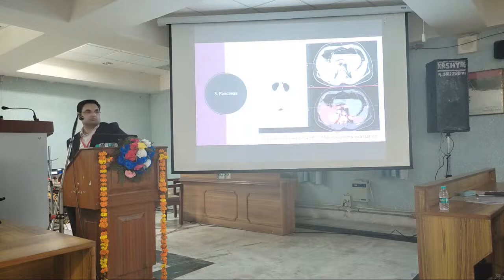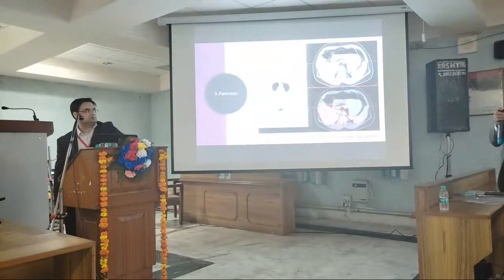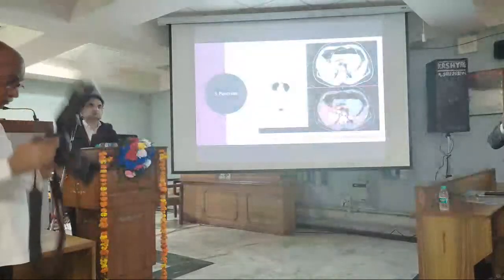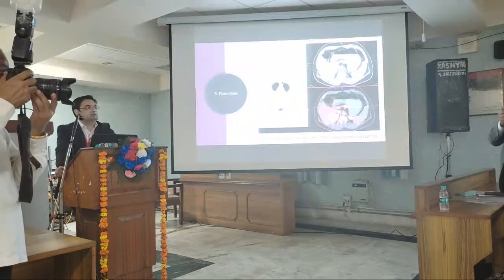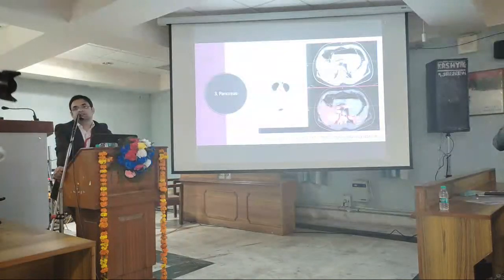So, just a comment on this. Even ultrasound is a very good modality to pick up the insulinoma. In our case, the CT missed it, but ultrasound said that it is there. Trained people can pick it up easily. Literature is saying that ultrasound is better than the... Sir, it is in fact endoscopic ultrasound which has a very good pickup, not a simple transabdominal one. Yes, we did it on a conventional ultrasound, and that was picked up.